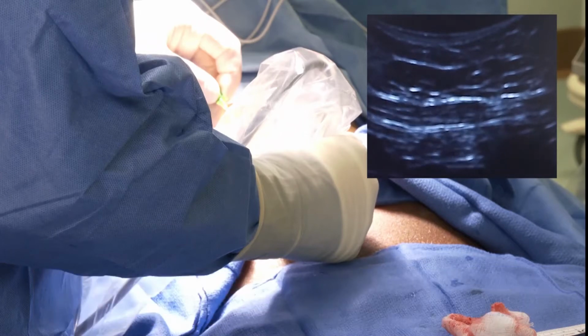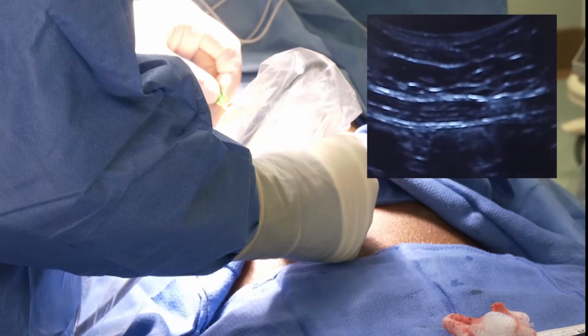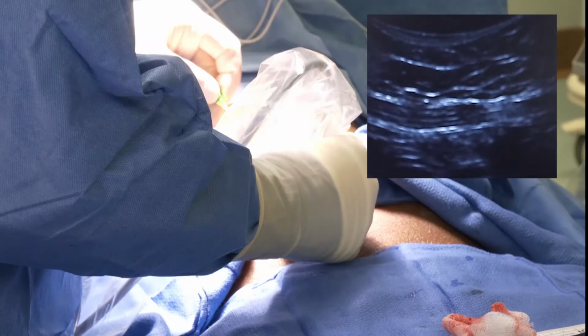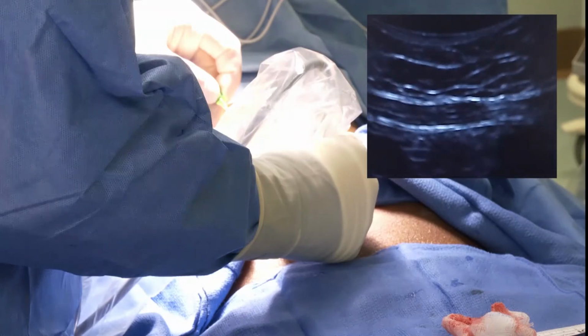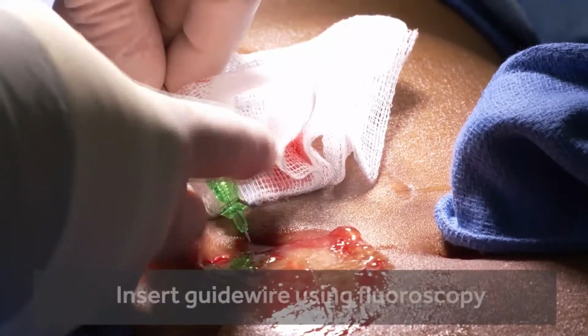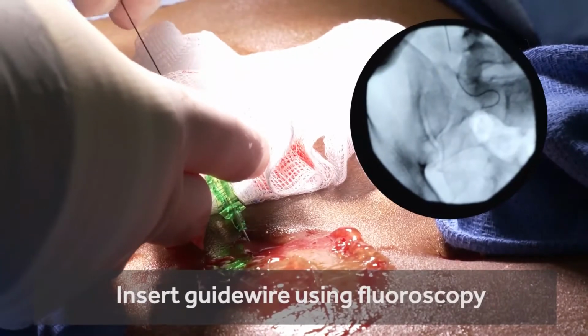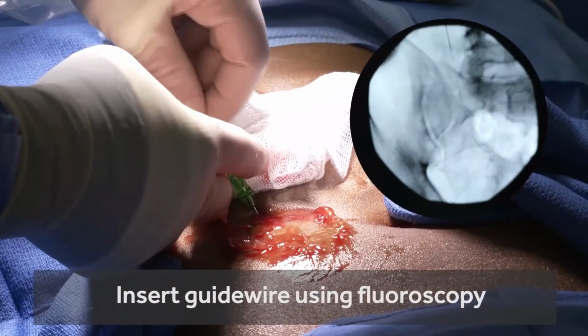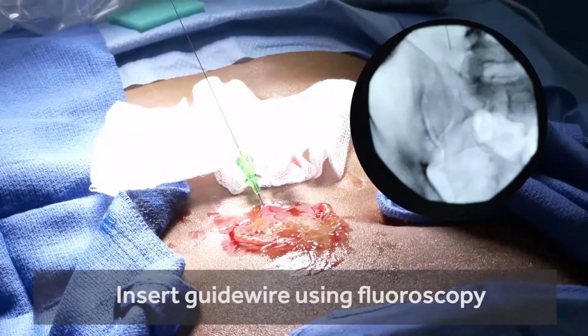After you've done several of these, you will get a sense of when you puncture the peritoneum: you will feel the pop or sudden release in tension of the needle, and you'll know you're there. Then I place the guide wire, and it should go easily without any resistance at all.